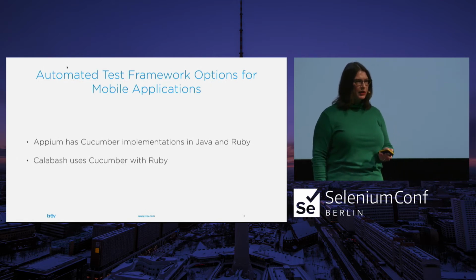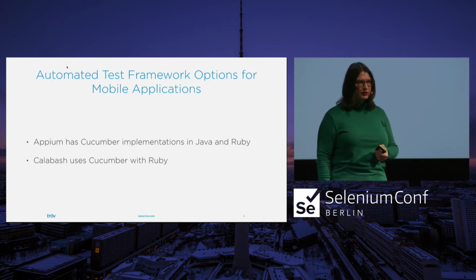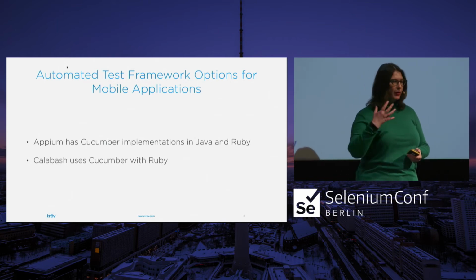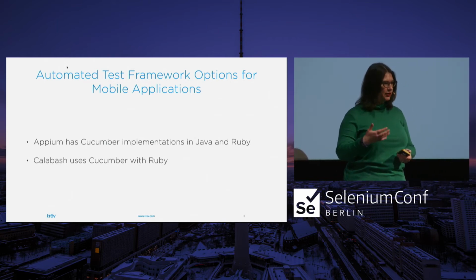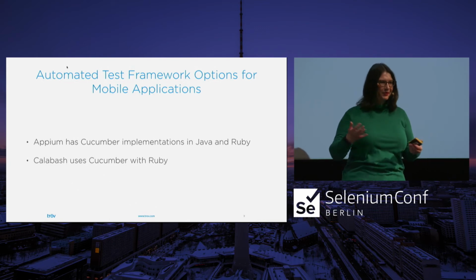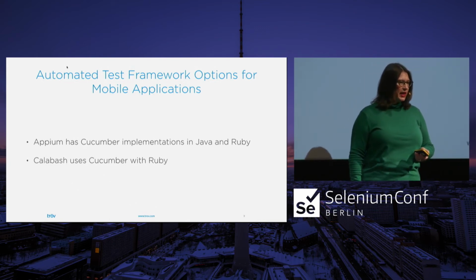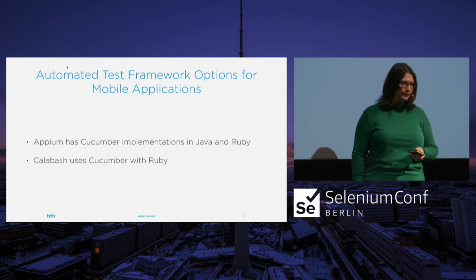If you had a web page that was interfacing with a medical device or providing medical device information, or displaying the output from your medical device to you so that you could make decisions about your health, you could use Selenium to test that with Cucumber as well.